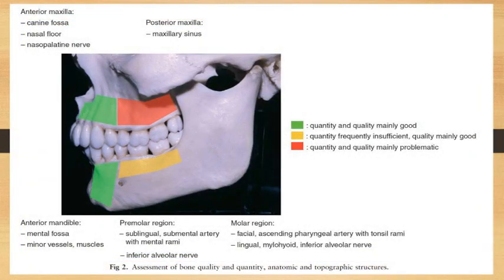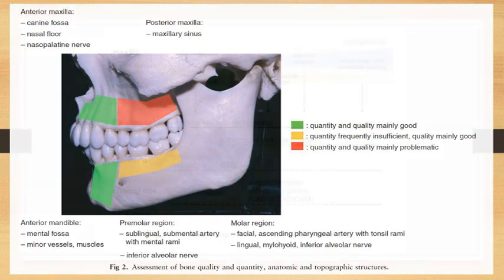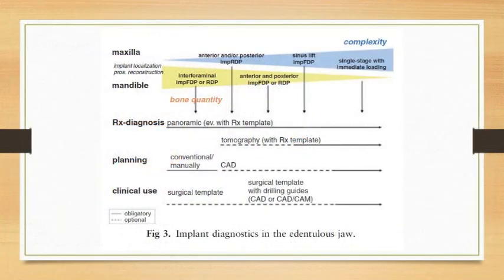The radiologic examination also aids in facilitating the evaluation of the bone quantity in the bucco-oral dimension, better orientation for the identification of anatomic structures and/or optimal implant positioning. This figure shows the radiologic diagnostics needed by a practitioner for specific cases.